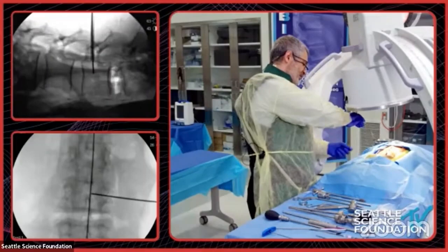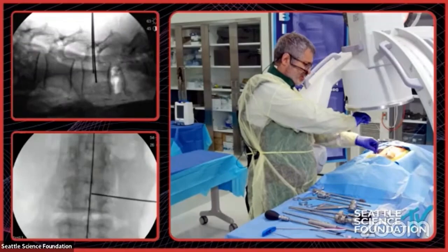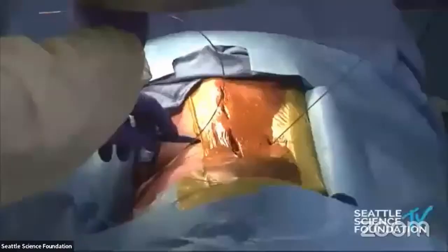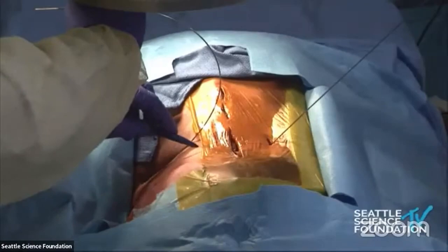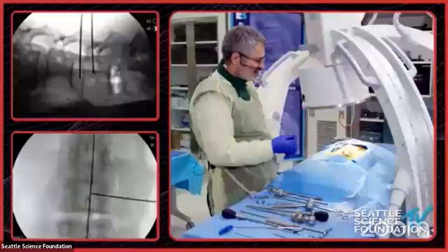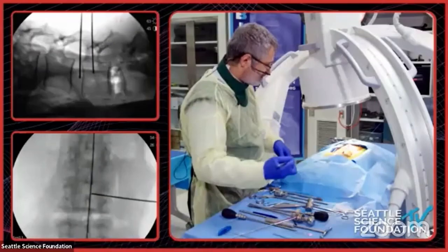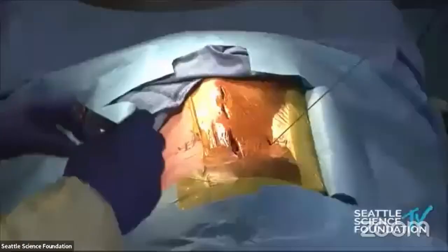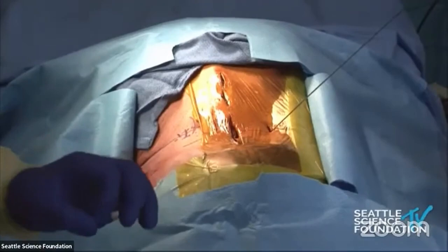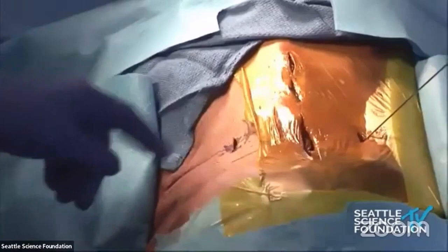For the lateral, I again use the elasticity of the K-wire. I mark the midpoint of the disc on lateral, and I transfer that distance to the midline, ending up with two lines. More or less, this is to be equidistant in the AP and lateral to the Kambin's triangle, so we can go at 45 degrees. Every person has different anatomy — it's not a certain distance or certain centimeter, just whatever the measurement gives you. Then I perform about a one and a half centimeter incision.